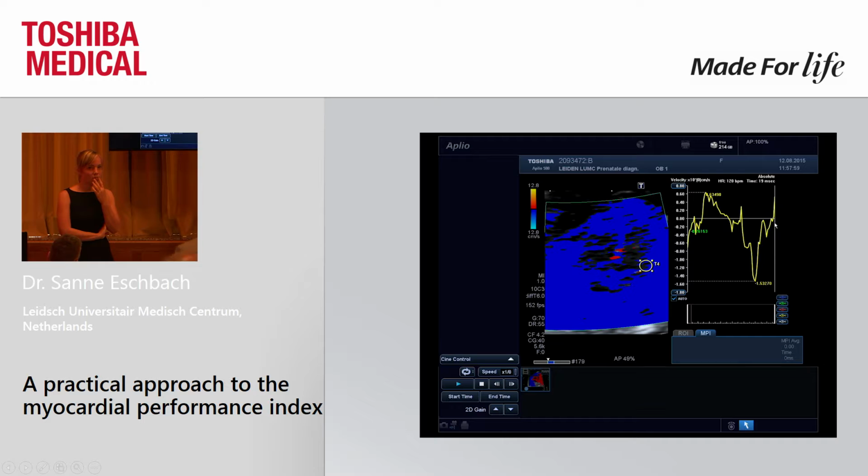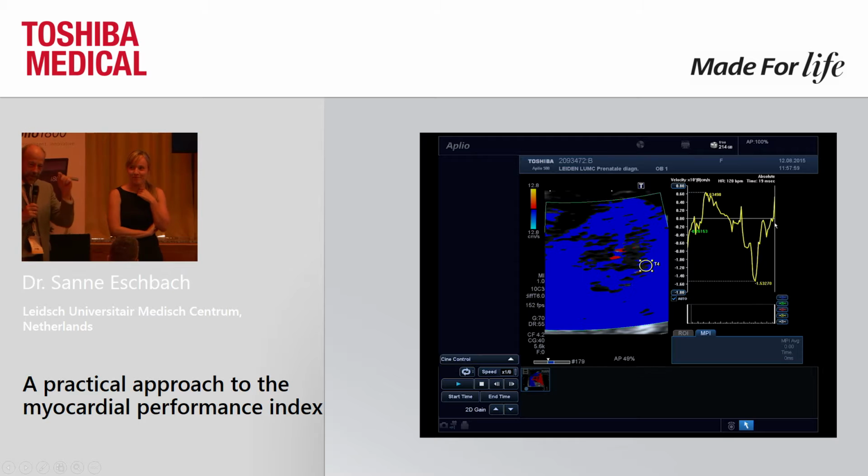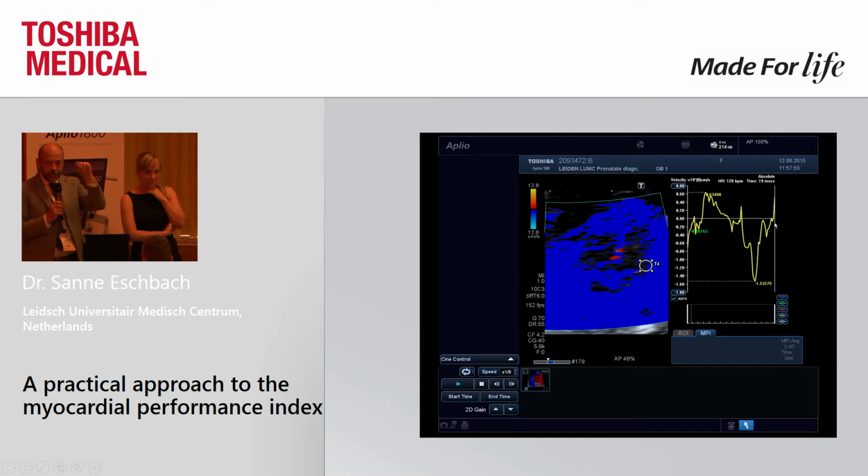It's a very good question about the temporal resolution. In fact, yes, I will answer that question from a technical point of view. The measurements are at the actual images, but because you have the interpolation, the actual usable time resolution is higher than 10 milliseconds. And there is a calculation with which you can calculate that temporal resolution.